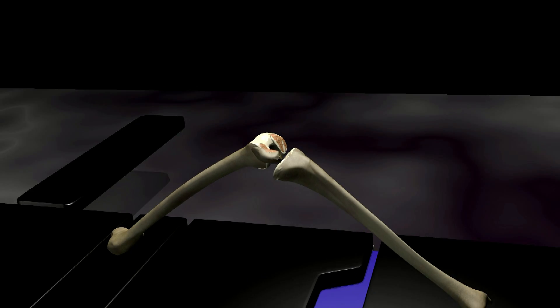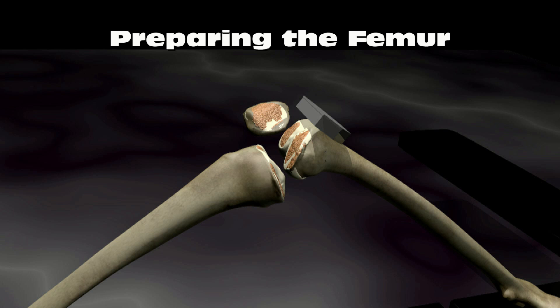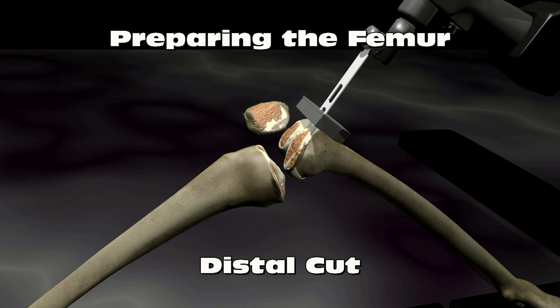Special instruments are used to measure the bones so that the appropriate implants can be chosen. Templates are used to line up the cuts so that the implants will be well positioned in relation to one another and the bone. An oscillating bone saw is used to cut the bone.